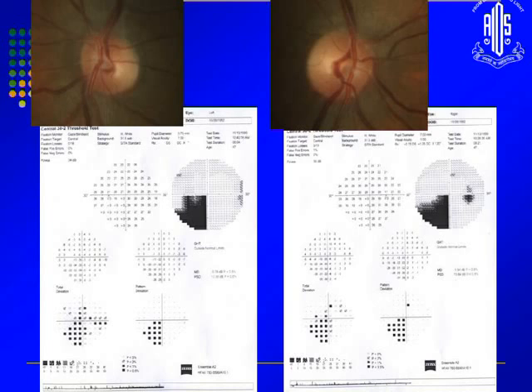Usually neurological lesions affecting the higher visual pathway tend to respect the vertical midline. Fairly normal looking discs. The patient has these defects. This is not related to glaucoma. It is related to a brain infarct in the past.